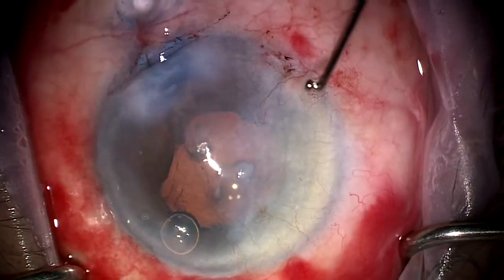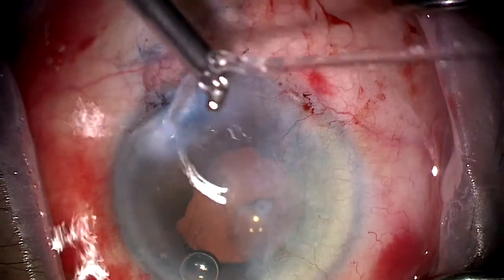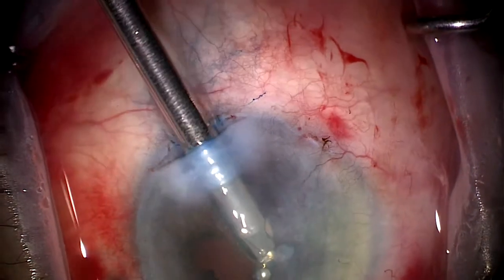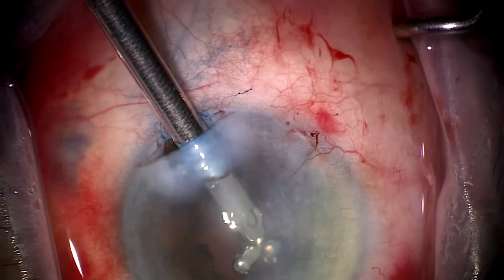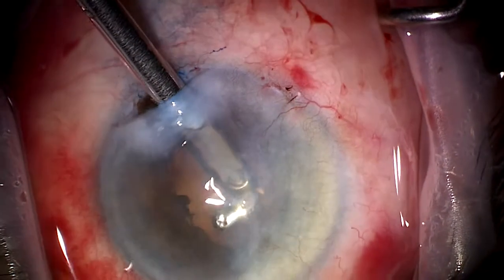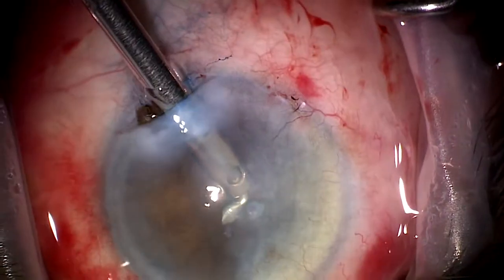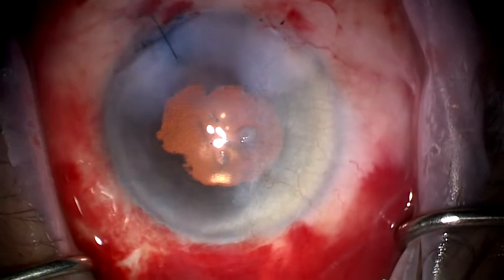At this point, we're ready to remove the viscoelastic from the eye, which we will do with a I/A handpiece. You can see the iris is fairly floppy in this case, and has obviously suffered a little bit of trauma from the Malyugin ring stretching the sphincter. In these cases, I like to suture the wound to ensure watertight closure. Thank you very much for your attention.